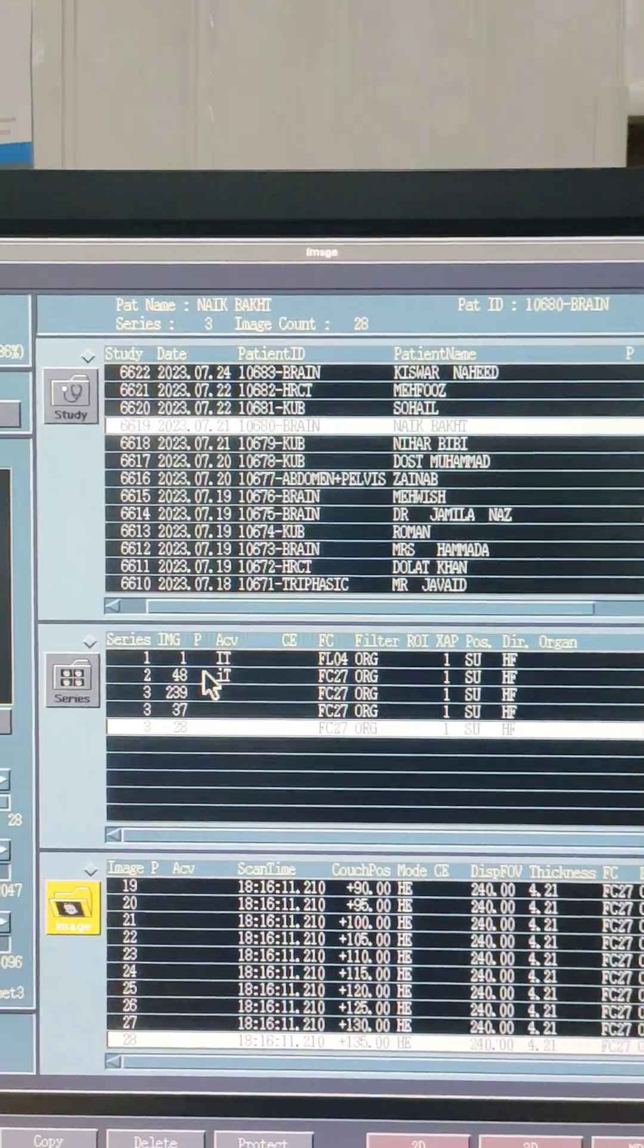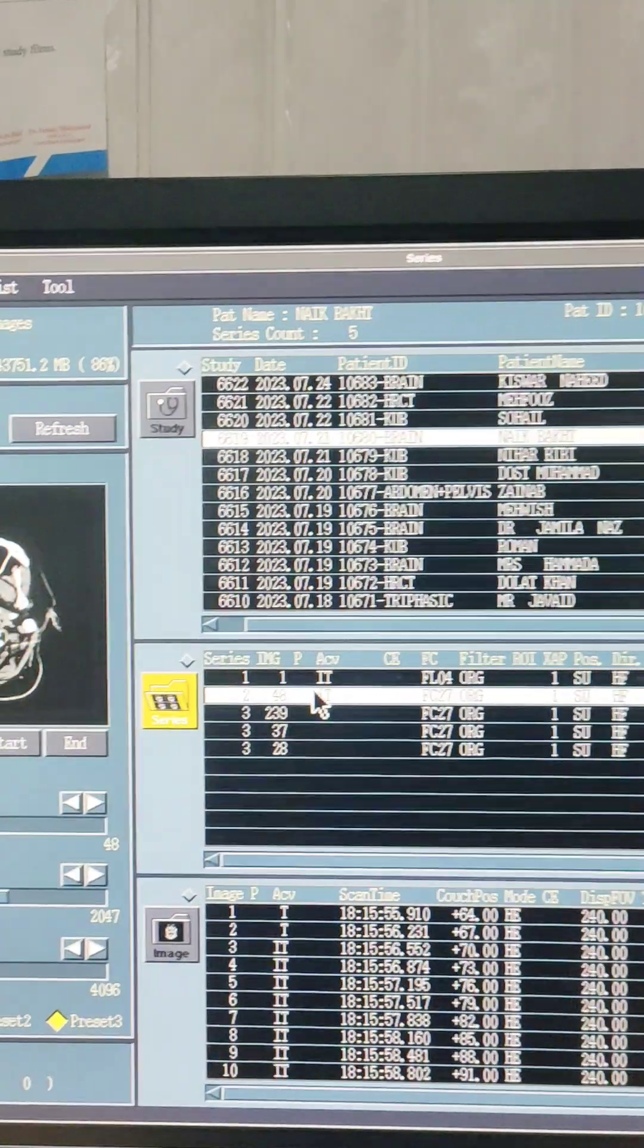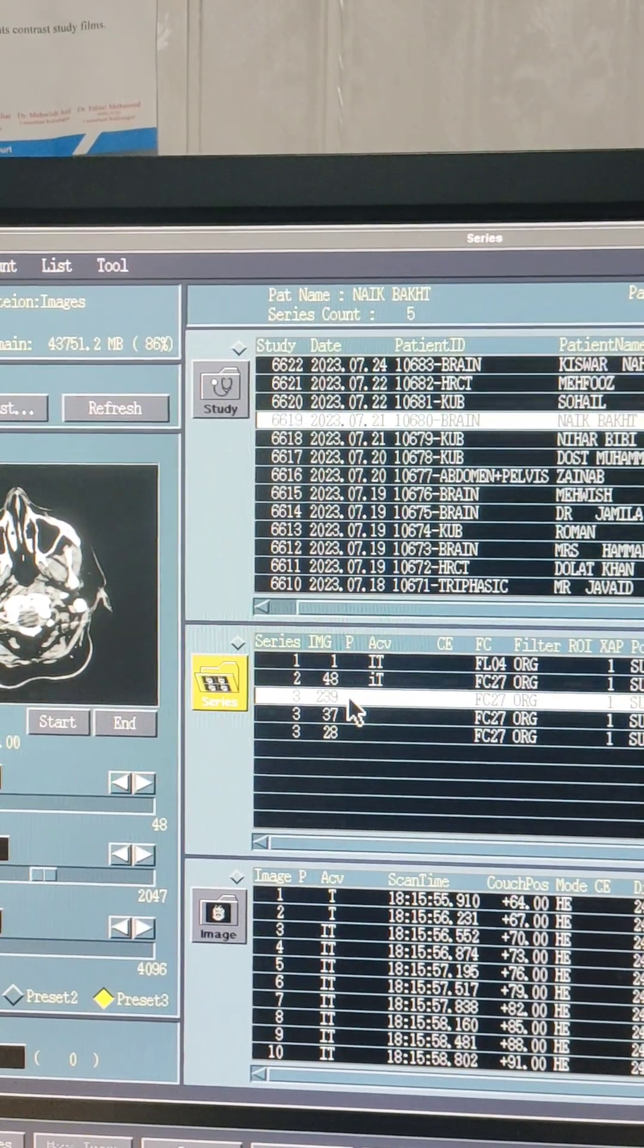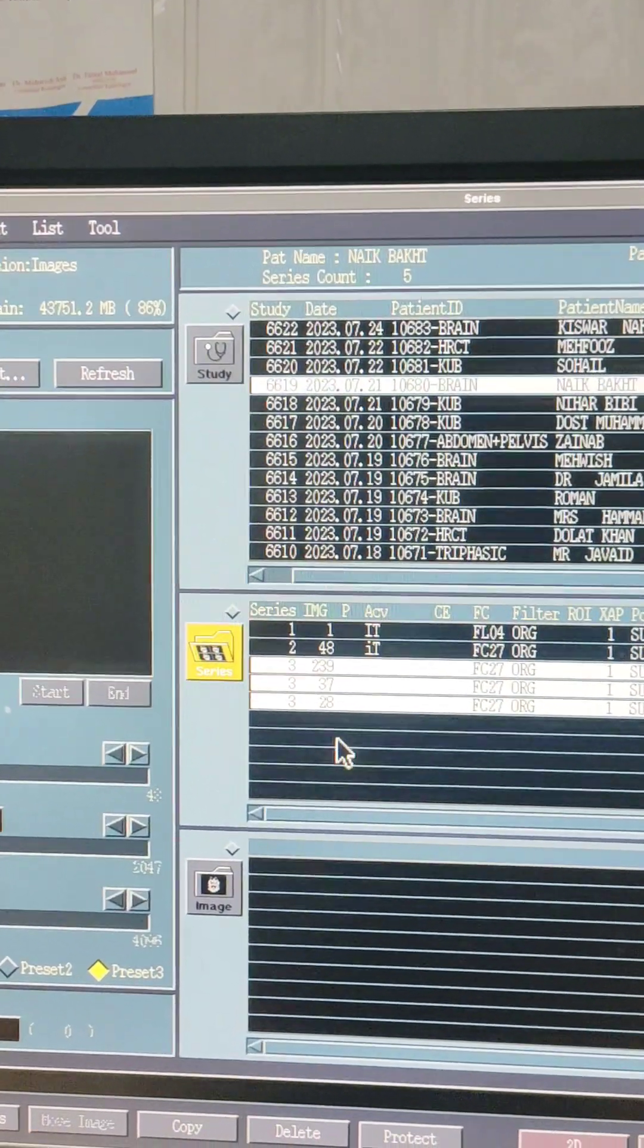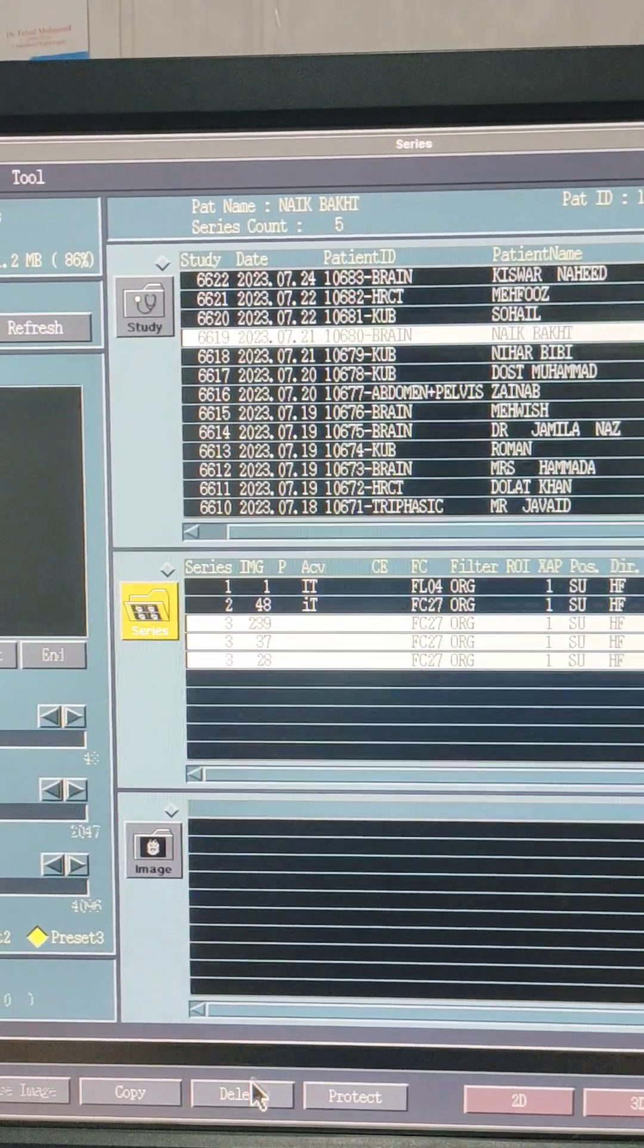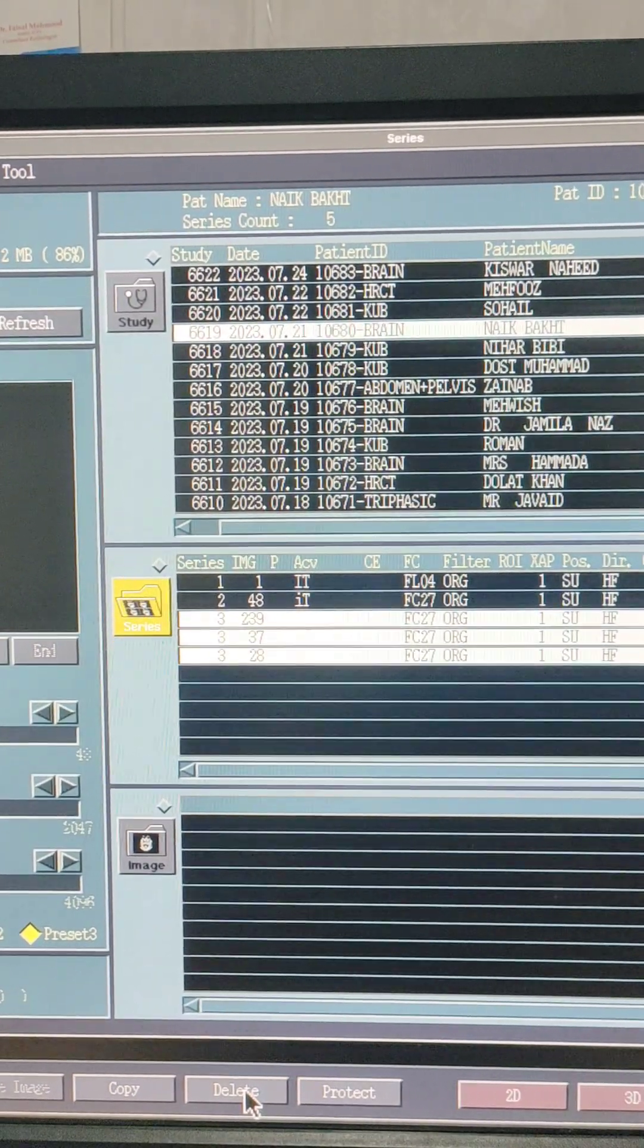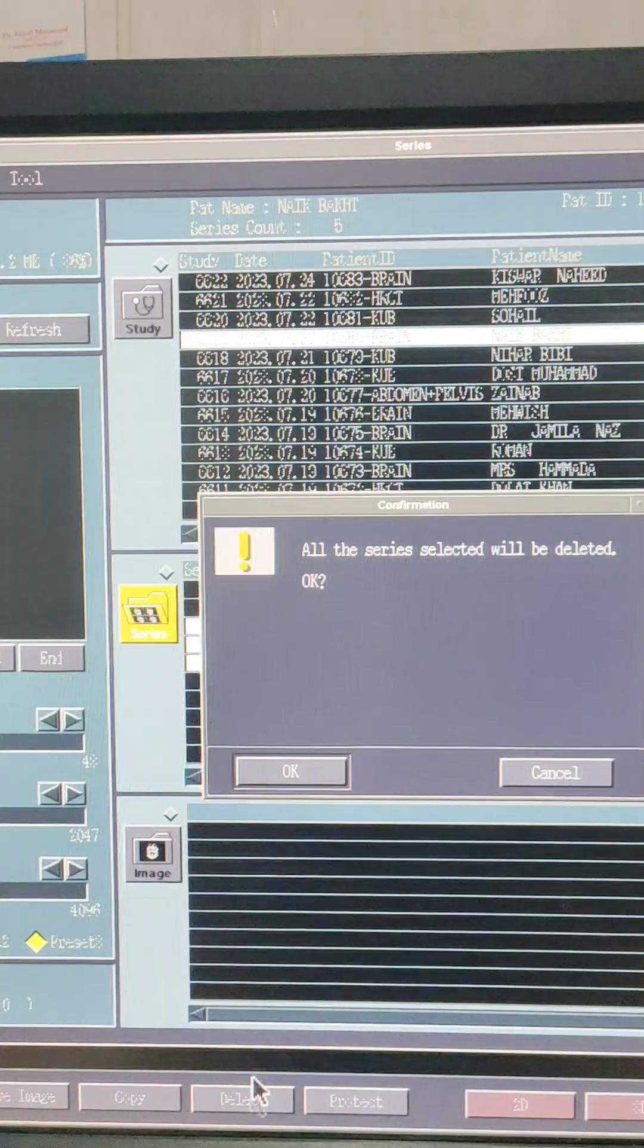Do not delete your primary study from your scan. You select scan tree study with your coronal sagittal images - that is not required for saving the patient data. Delete them.